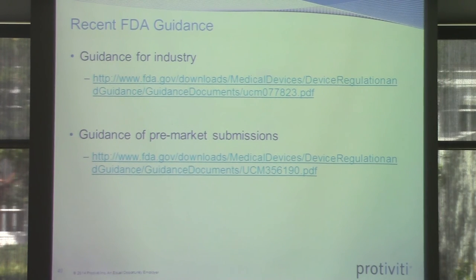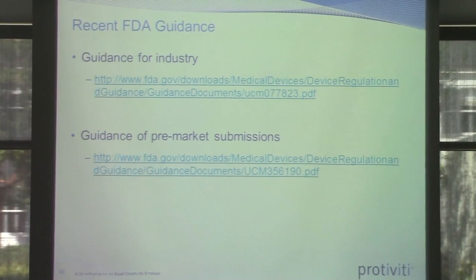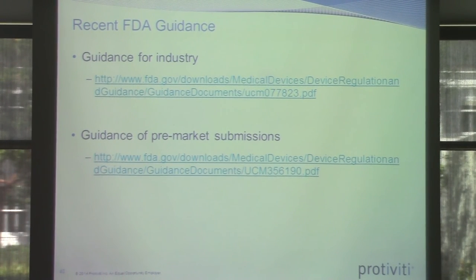Yeah, I see the question. So the FDA's involvement, other industry working groups, right? They've taken a hands-off approach. I think one, they would like industry to solve it. Two, currently, quite frankly, they don't have the resources to assess security controls at that level. And there's many factors. I mean, there's tight turnaround on 510K submissions, which is what's required for a device prior to getting pre-market approval and going to market. And they only have 90 days to turn that around currently.